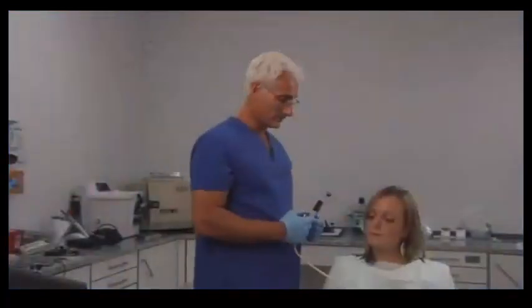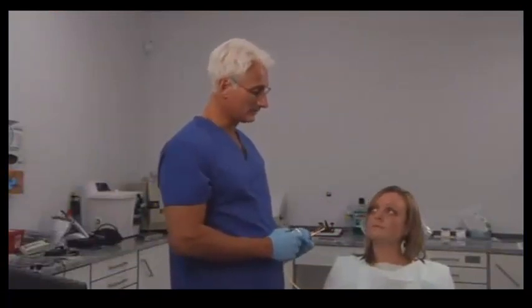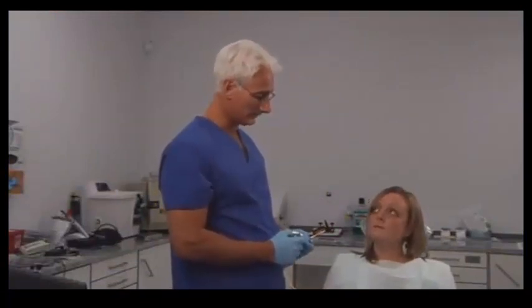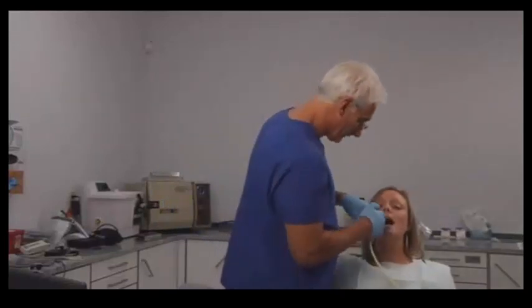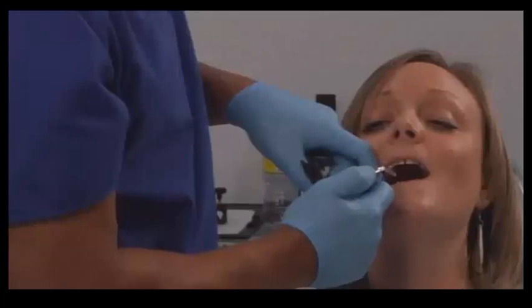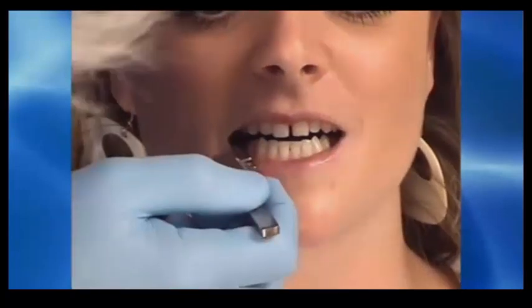So now I'm going to mark your teeth with the articulating paper so we can locate where the long disclusion contacts are present on your teeth. So put your head back for me. I'm just going to dry your teeth. Now I'm going to place the articulating paper in between your teeth. I want you to bite down for me.